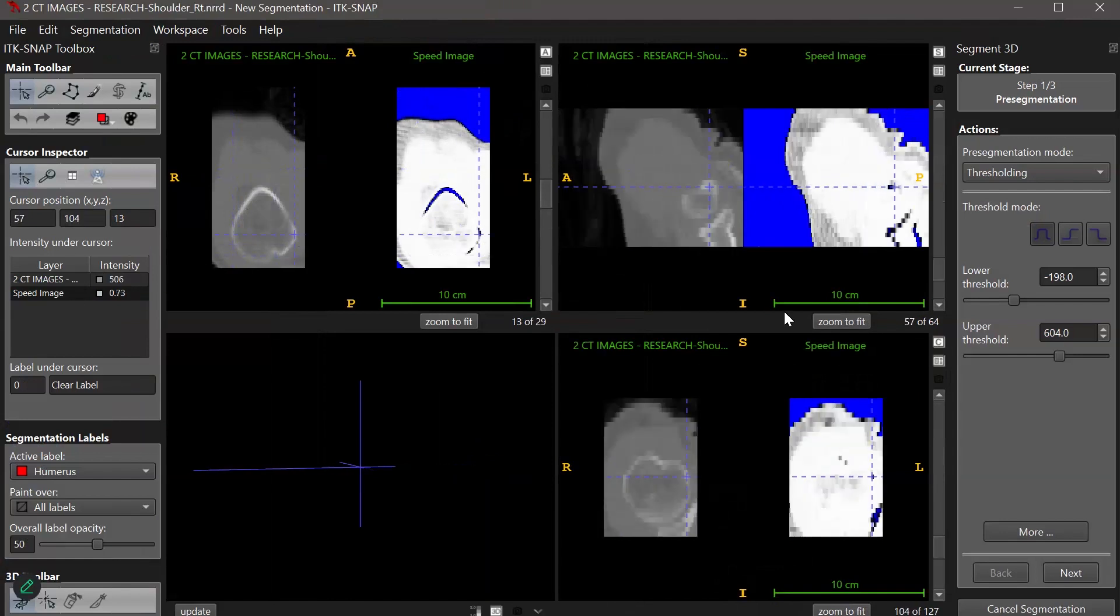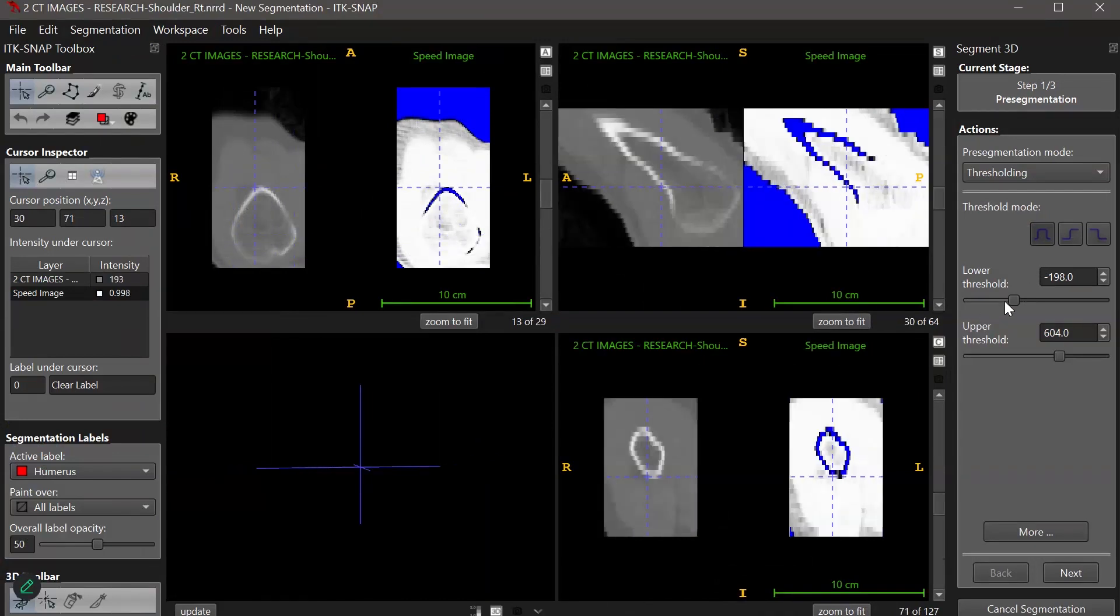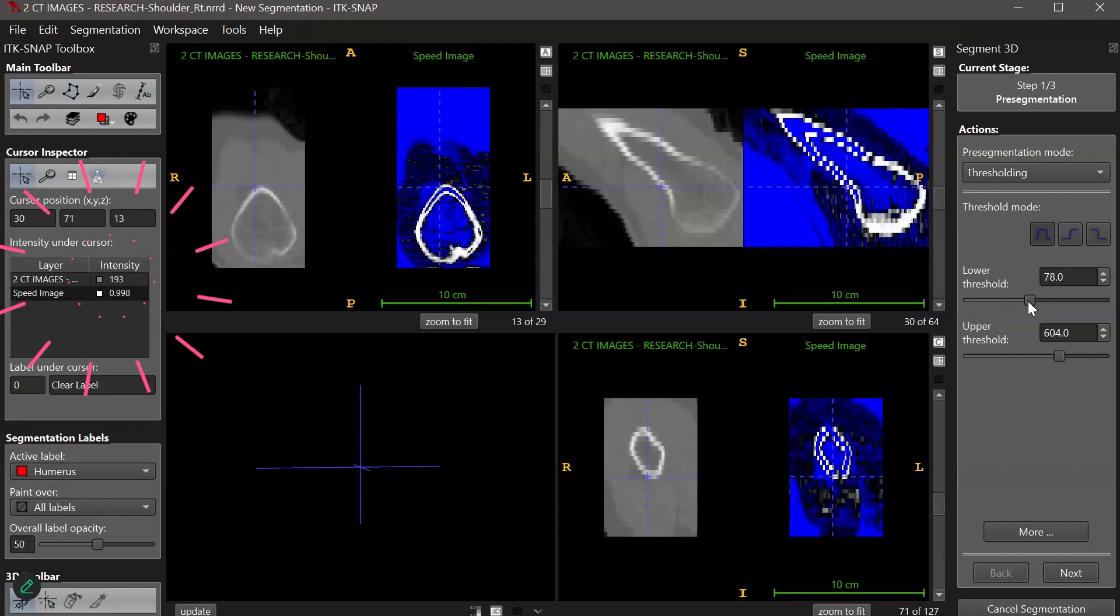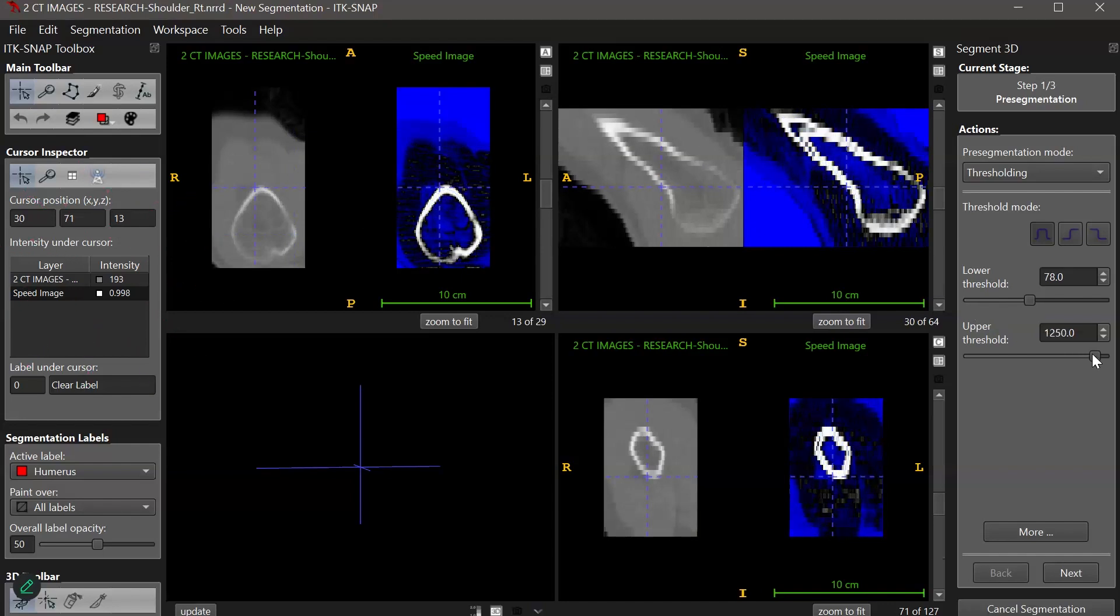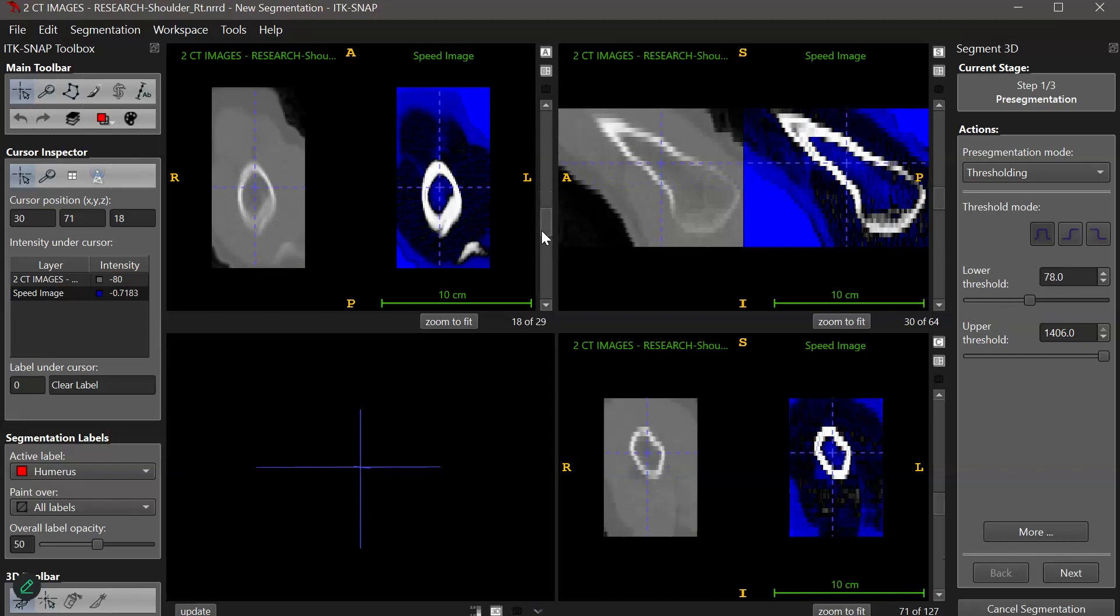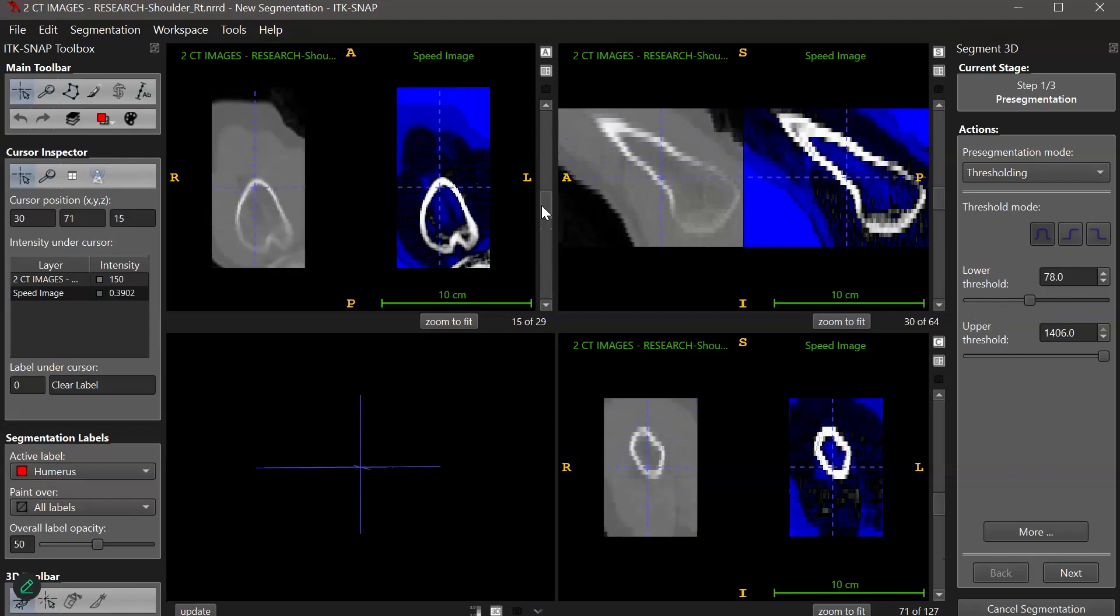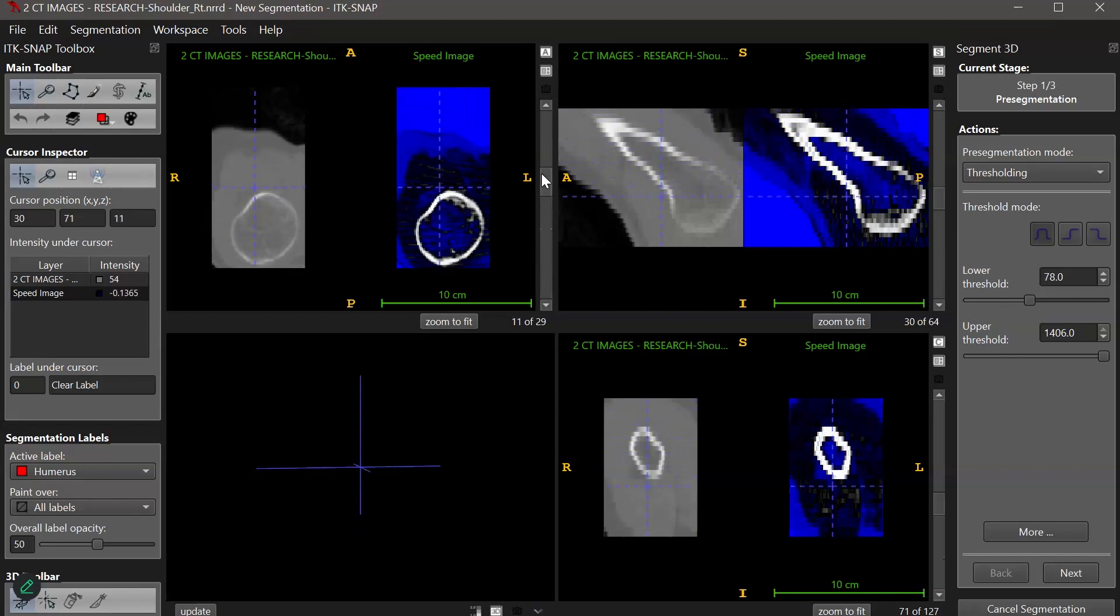To get a ballpark of the pixel intensity values, I can use the cursor to click around and find values. On the left-hand side of the screen, there's a panel that tells me the intensity of the pixels where my cursor is. My goal is to set a threshold that filters out the intensities that I want.